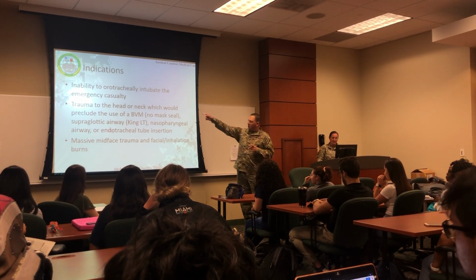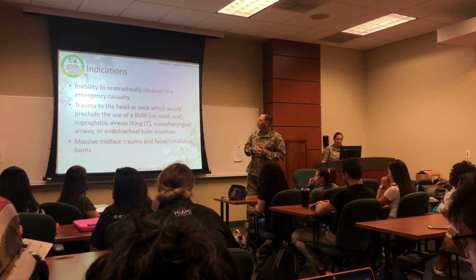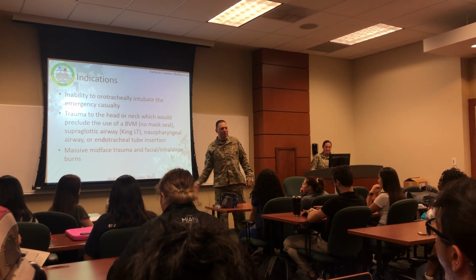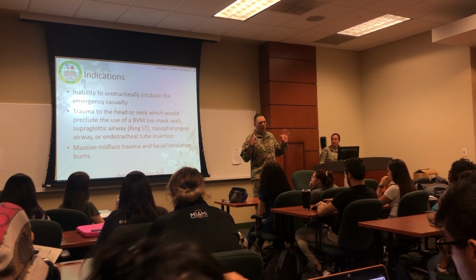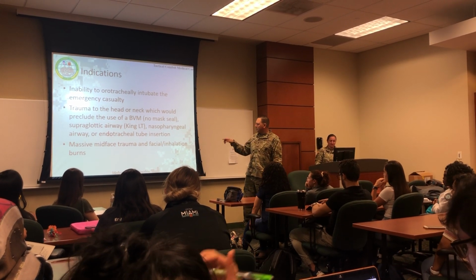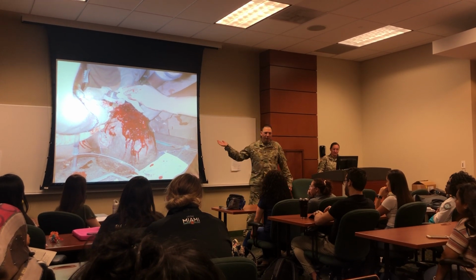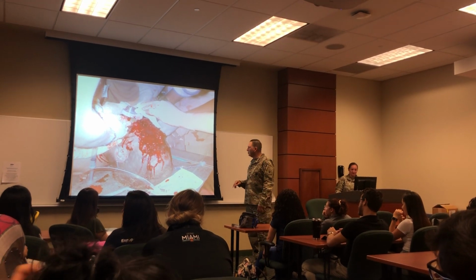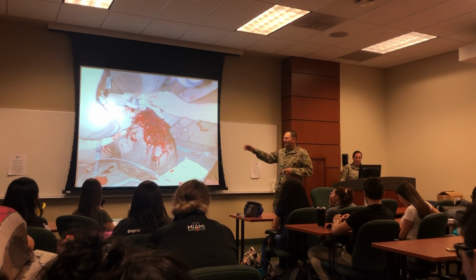Okay, indications talking about pretty much what I just mentioned here. It just tells you inability to orotracheally intubate an emergency casualty, right? Your NPA is useless, your King LT is useless, massive facial trauma or burns to the face. Now you're going to need your cric kit. Okay, we call it cric for short. Next slide, please. You can see here, this person right here, perfect candidate for a cric, right? So other than that, this guy's having a bad day here. And other than that, go to the next slide.